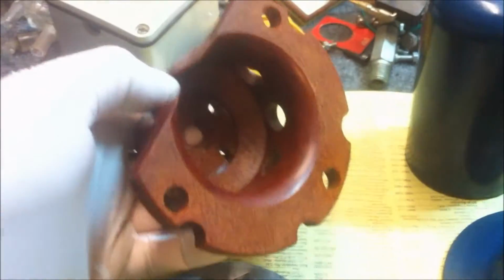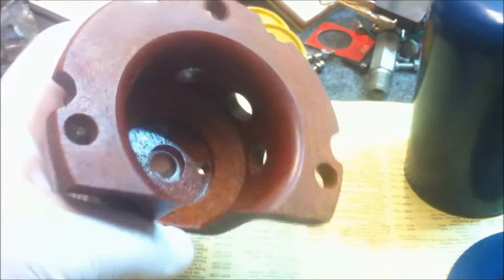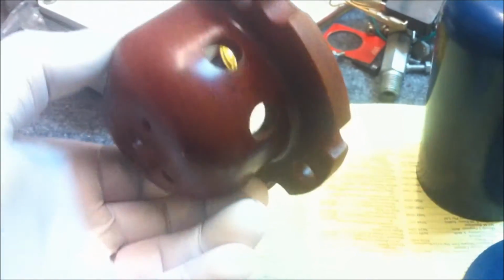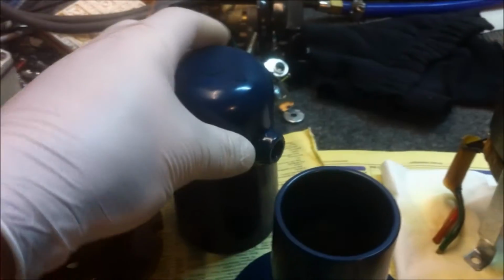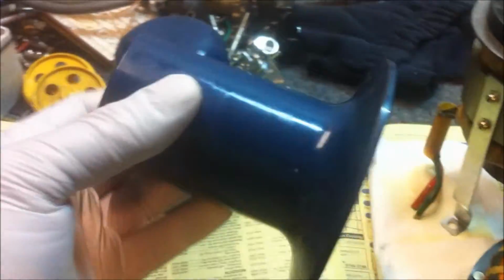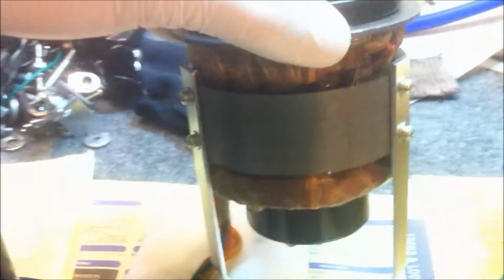And I also kept this little guy. Again, you don't see that sort of handiwork too often, so I thought I'd keep it. Maybe I might be able to make use of it, maybe not. But these things I'll definitely be able to use. Some blue ceramic plastic looking shrouds. And there's another one sitting inside this winding here.